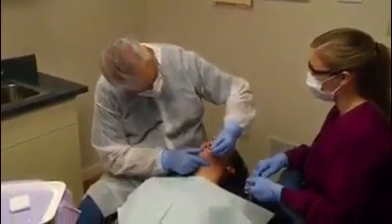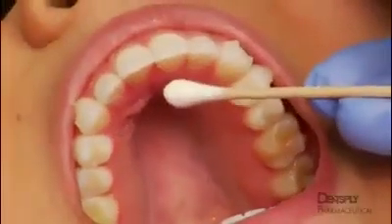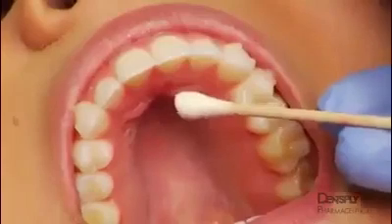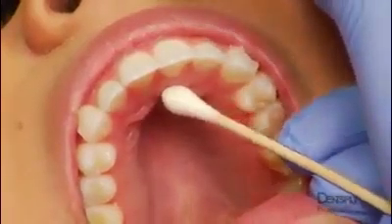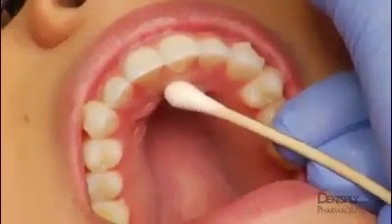The injection site is the palatal tissue lateral to the incisive papilla, which is located at the midline. Never insert the needle directly into the incisive papilla, because this can be extremely painful. Pressure anesthesia is performed utilizing a cotton-tipped applicator on palatal tissue on the contralateral side of the incisive papilla.